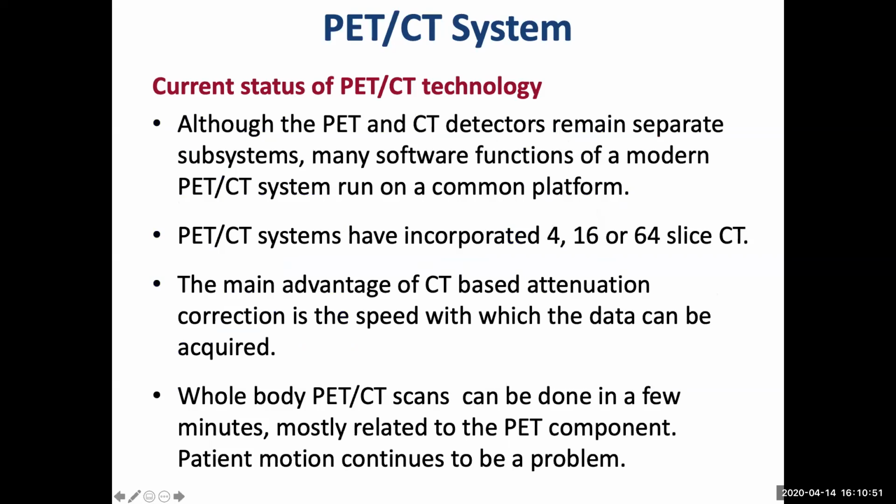The current status of PET-CT technology. The PET and CT detectors remain separate subsystems. Many software functions of modern PET-CT systems run on common platforms. So we have one acquisition and sometimes one processing workstation, and they are working under the common platforms.